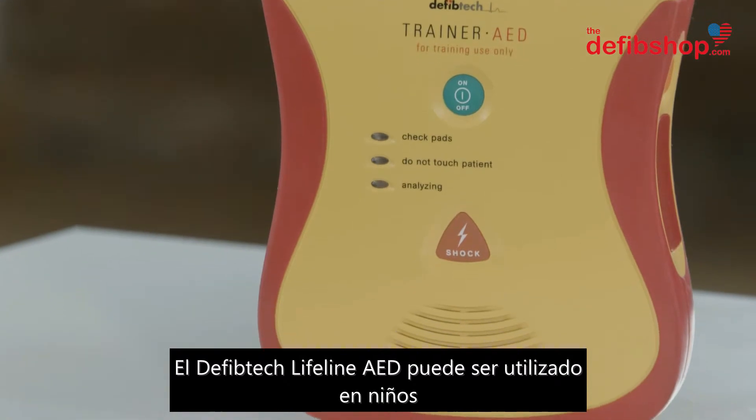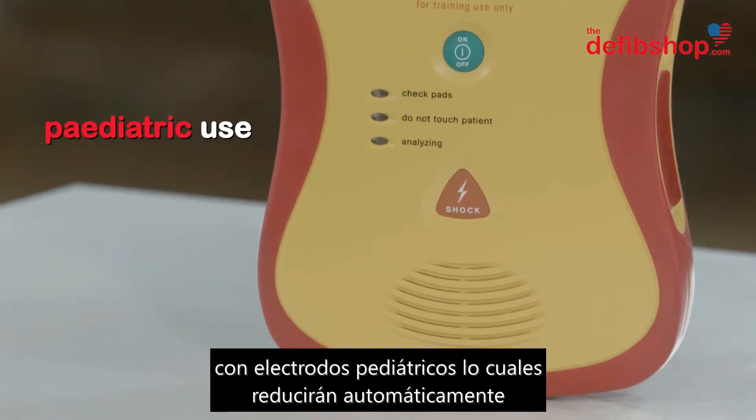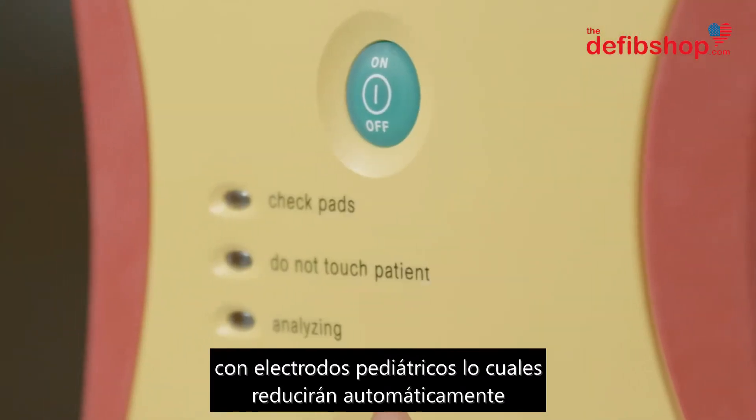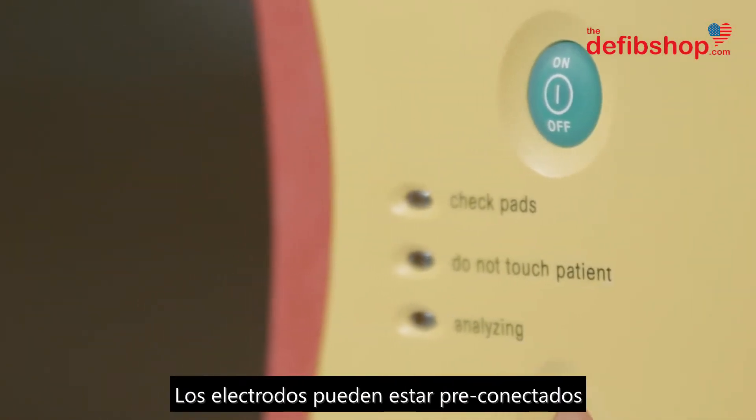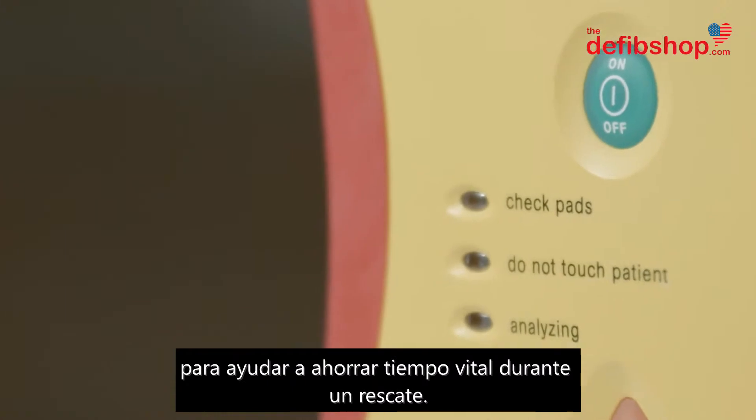The DefibTech Lifeline AED can be used on children with pediatric electrode pads, which will automatically reduce the shock delivered to a safer level. Electrode pads can also be pre-connected to save vital time during a rescue.